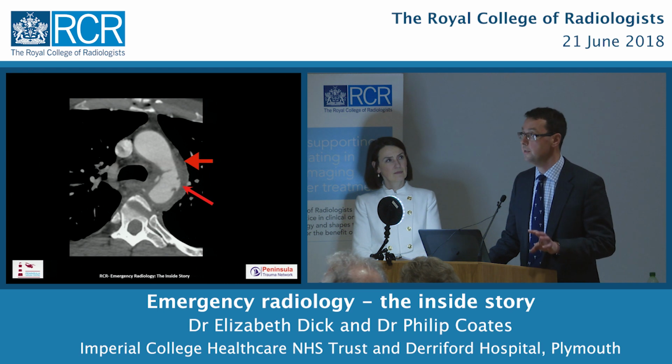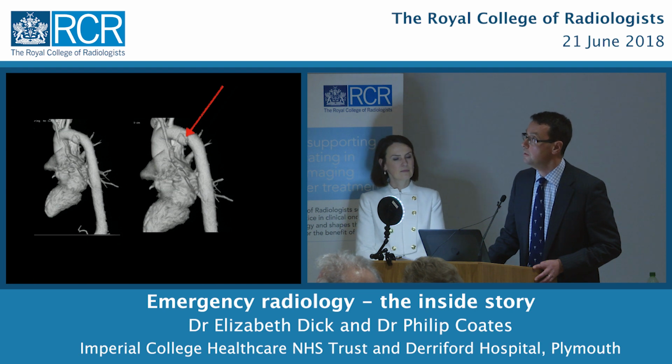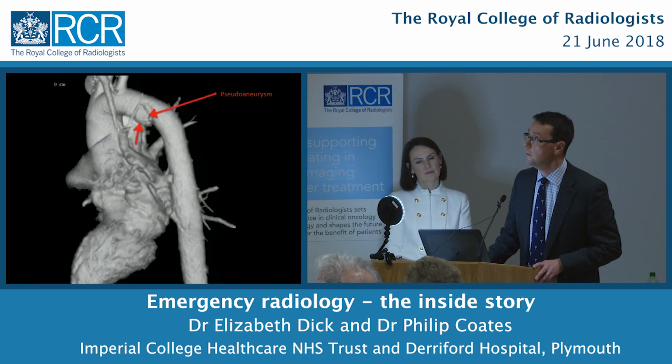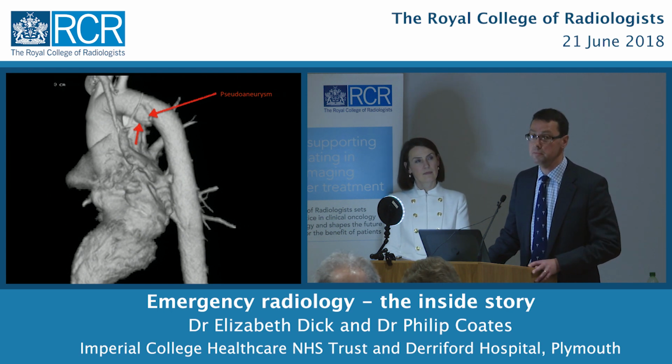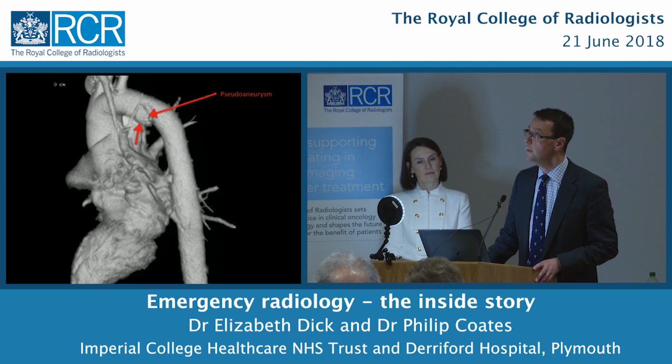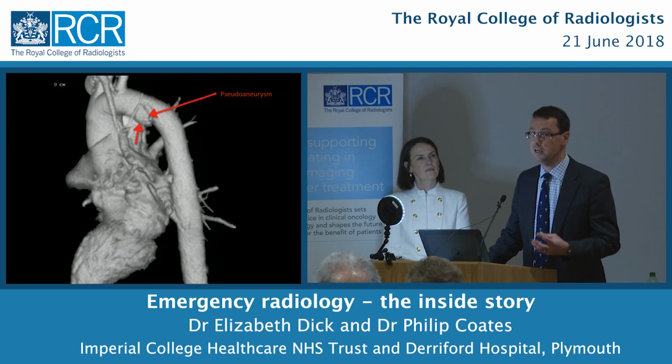There's a suspicion of a pseudoaneurysm, so a leakage of blood contained by a very thin layer of blood vessel wall and surrounding blood clot. So he goes into the CT scan and it shows, when we do a 3D reformatting exactly that injury, there's a pseudoaneurysm on the aortic arch there. The management for this, previously in years gone past, it would have been open surgery, but that was associated with a high mortality. The treatment is by interventional radiologists and surgeons to go in through the groin and put a stent graft in. So that's a stent, woven metal with material attached to that.